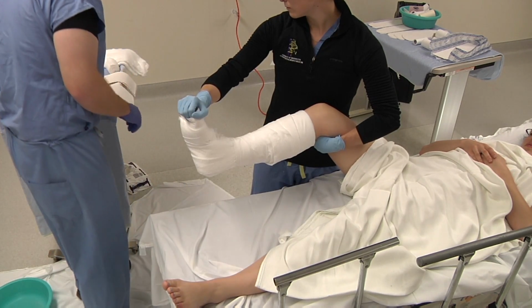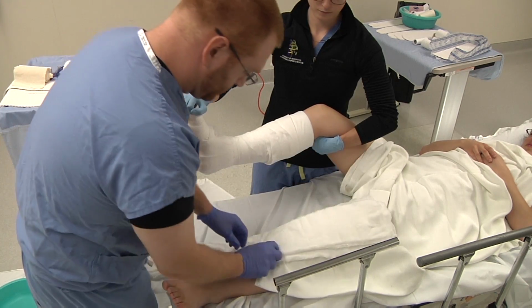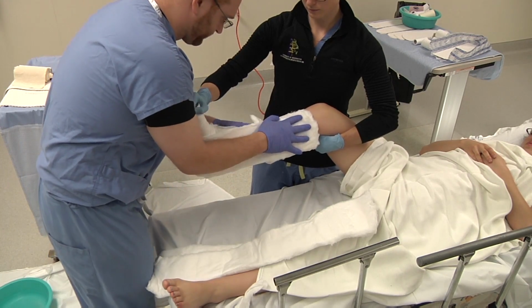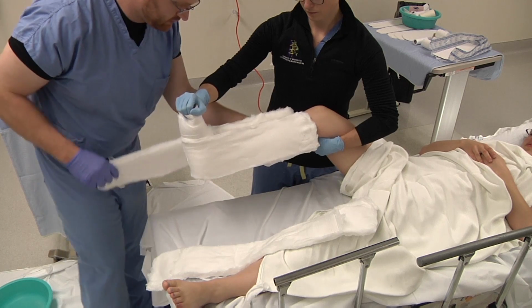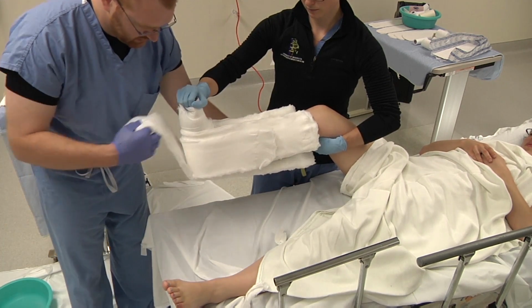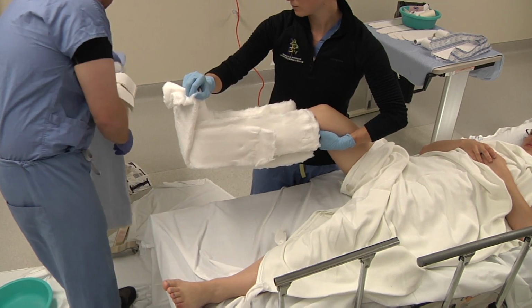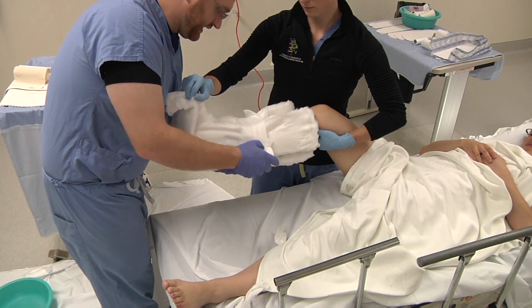From here, depending on the degree of reduction needed or the fracture, in addition to fractures that have a high potential for swelling, we can add bulky padding. There you can have your assistant hold that. 1 or 2 layers just to tack this down.